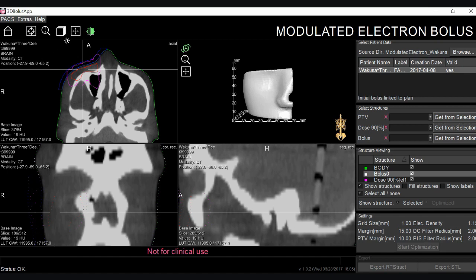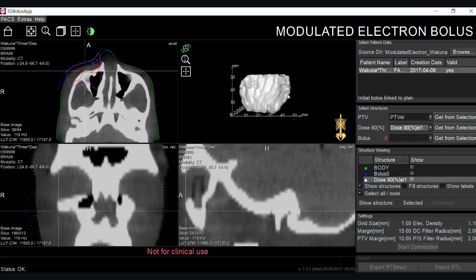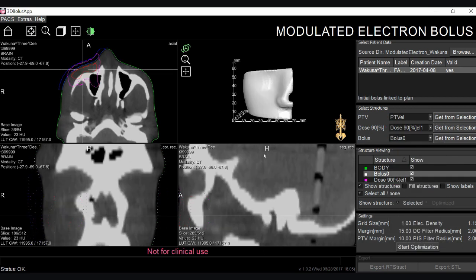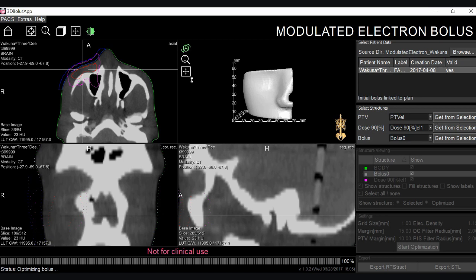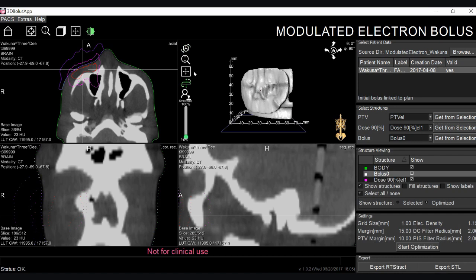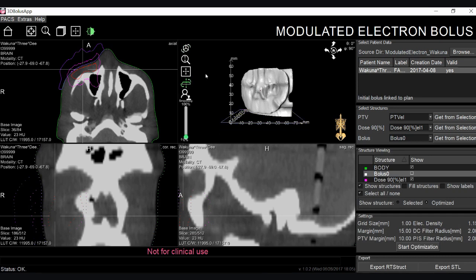The three structures needed to properly modulate a bolus are an initial bolus structure created in the treatment planning system, a prescription isodose line converted to a structure, as well as a target volume. We can select those three parameters from the drop-down menu and select start optimization. Editing features such as a cropping plane and smoothing are available in the new 3D rendered model of the modulated electron bolus, which can be seen here in this axial slice.